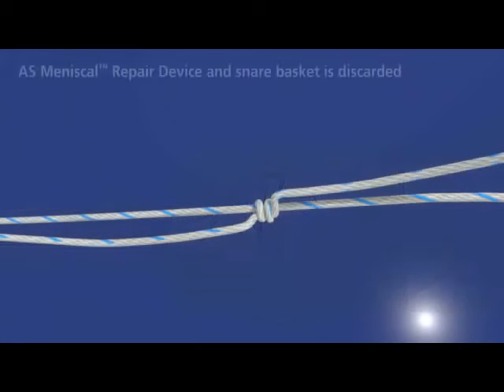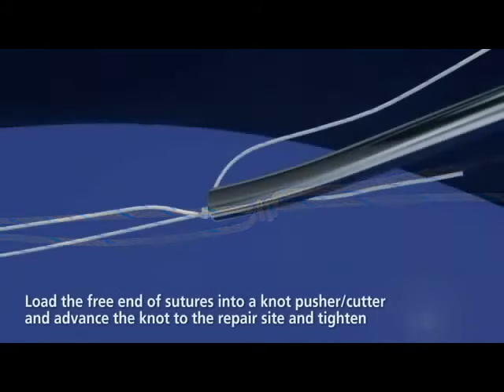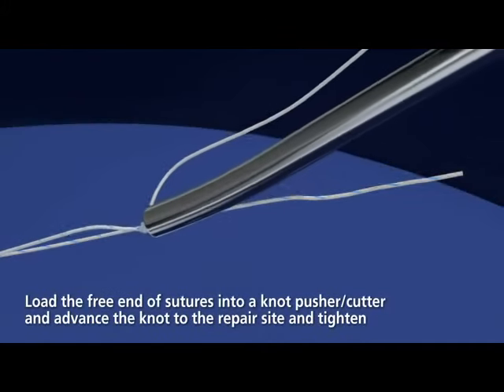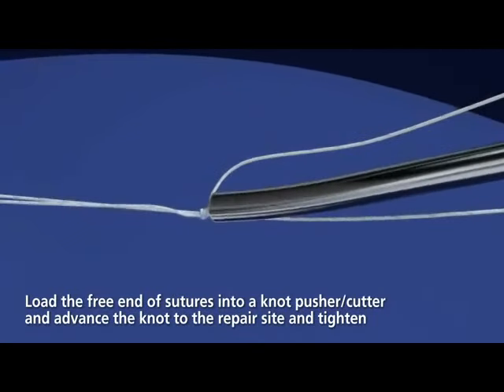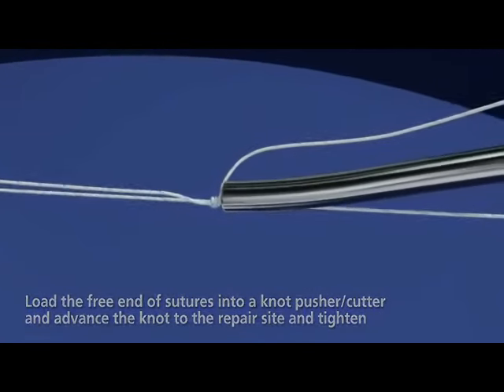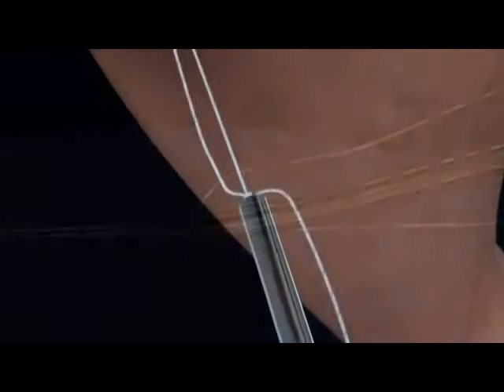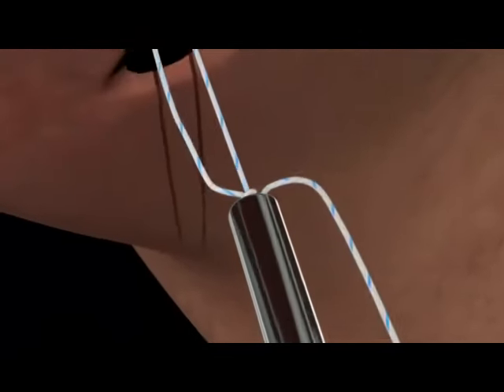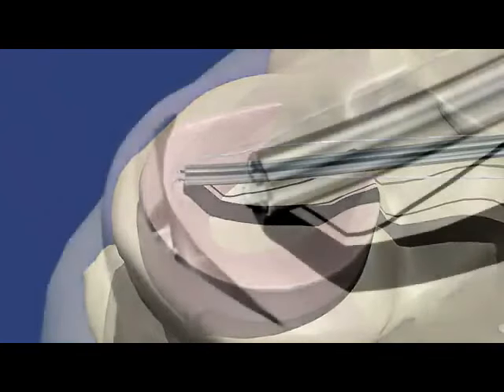Discard the AS meniscal repair device and snare basket. Load the free end of the suture into a standard knot pusher. Apply traction to the suture post to remove any slack in the suture. With the knot pusher, advance to the repair site.